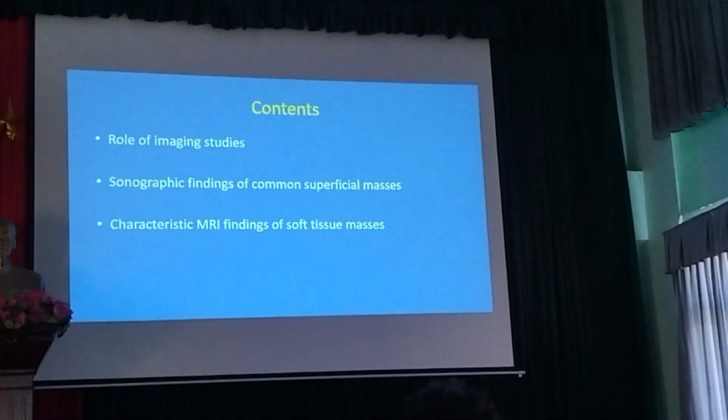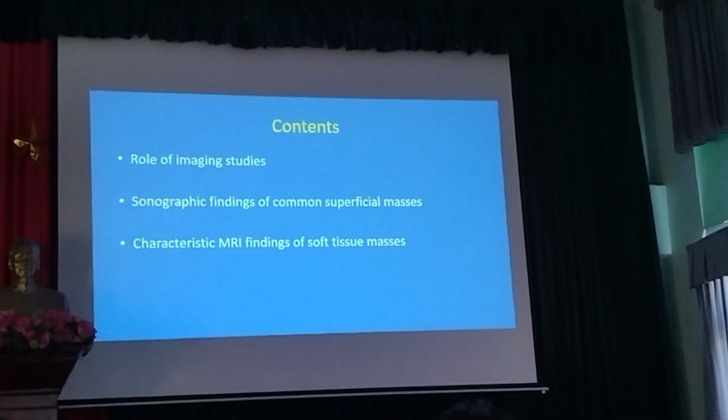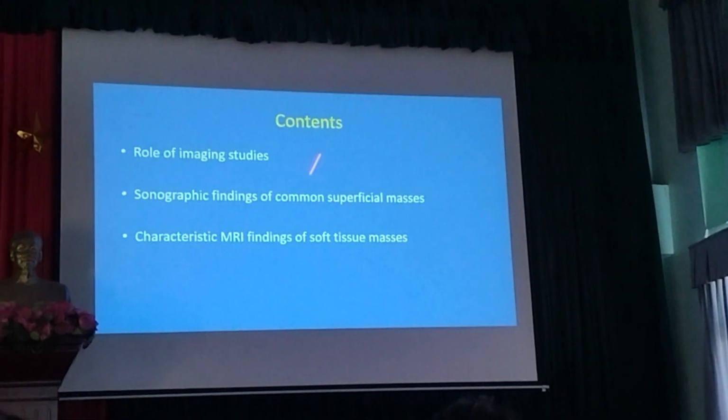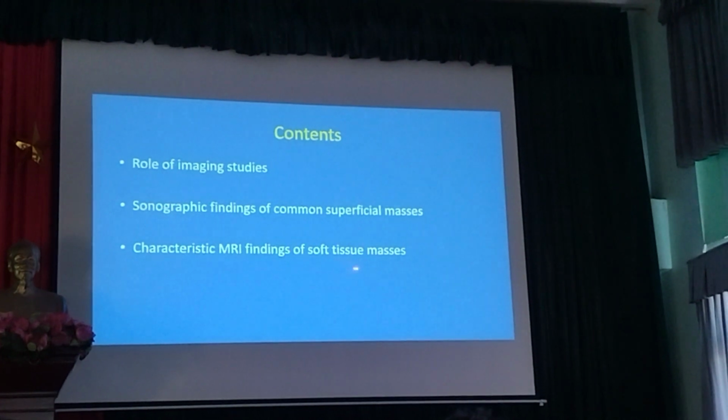And I will focus on the role of imaging studies, a little bit about sonography, which is ultrasound, and is commonly used for soft tissue, superficial soft tissue mass, and I will tell you about MRI of soft tissue mass.